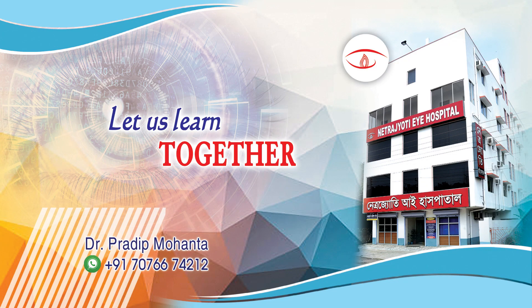In this video, we are going to watch phacoemulsification of a cataract with grade 3 nuclear sclerosis.